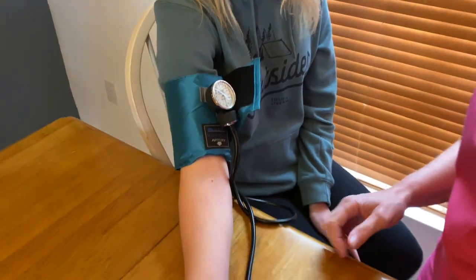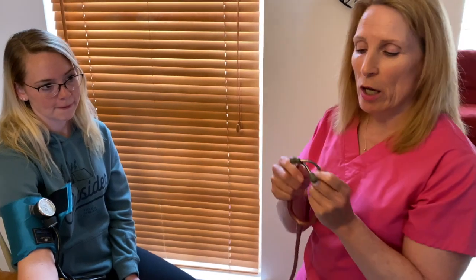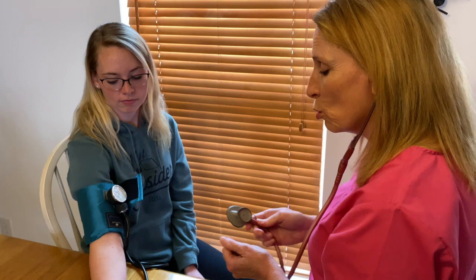So my next step is to make sure that the stethoscope is in properly. So you need to make sure that the earpieces go into the hole areas, not the opposite way in which it would be in the back of your ears. So I'm going to place my stethoscope in, then I'm going to tap that diaphragm to make sure that I can hear it. If I can't hear it, then it needs to be turned. So in this case, I can hear it, so I tapped it again and I'm ready to listen for a blood pressure.